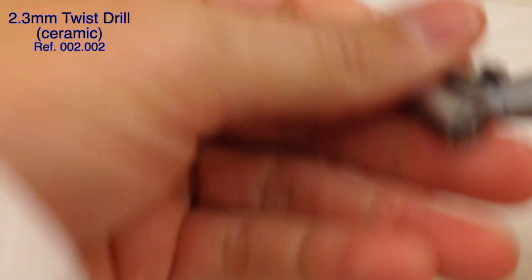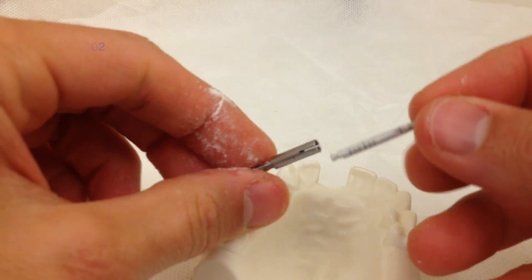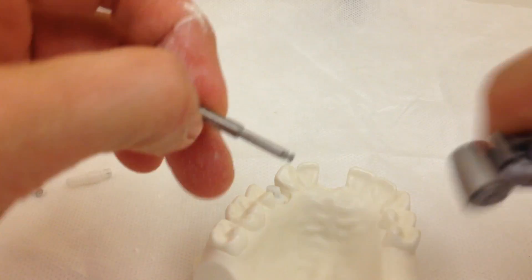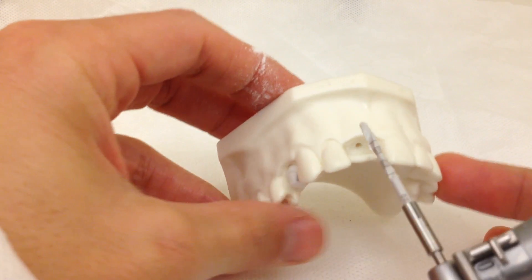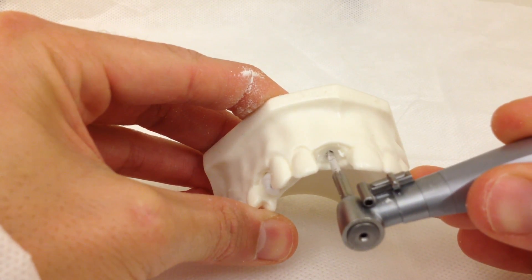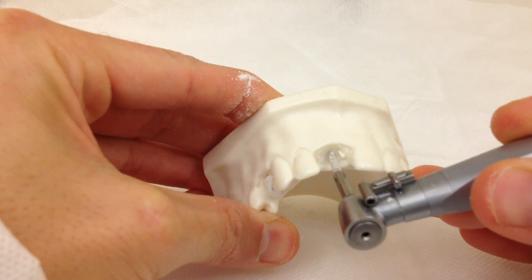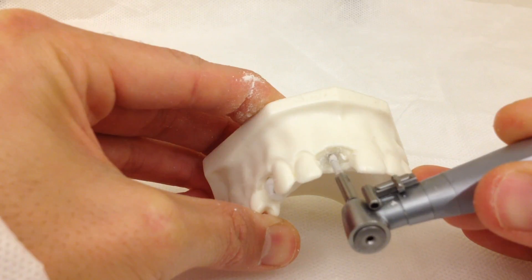We're going to need the drill extender now. Right now we are at 12 millimeters and we have to drill two more to reach the 14 millimeter line, and that's it — right now we are at 14.